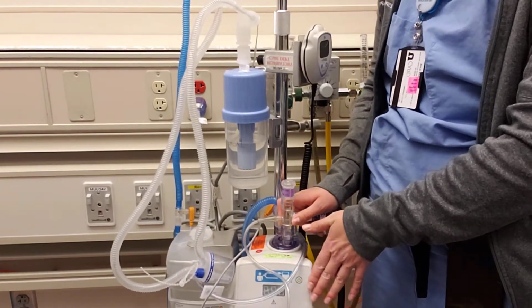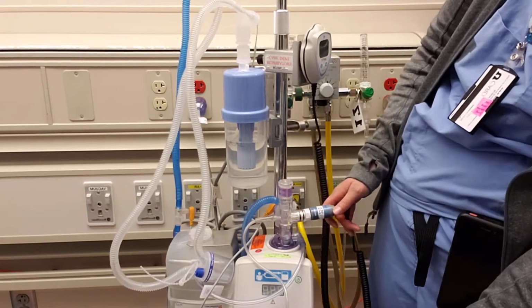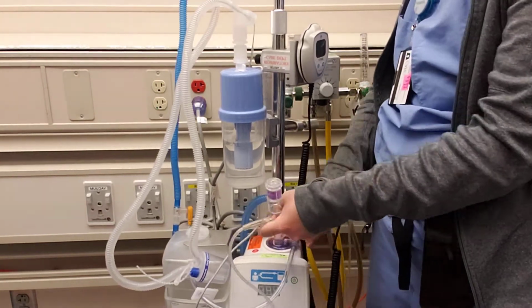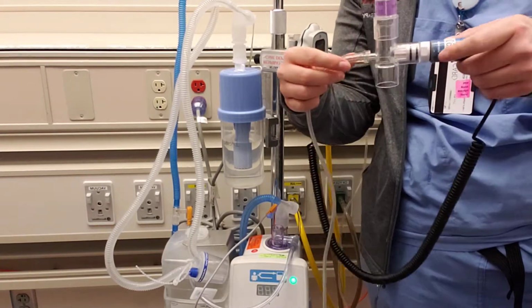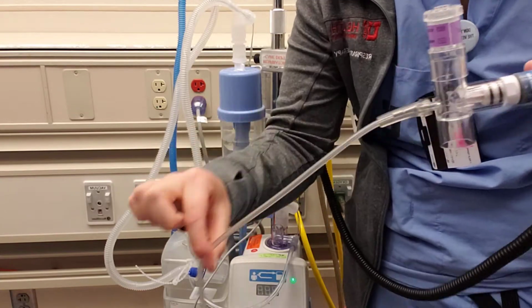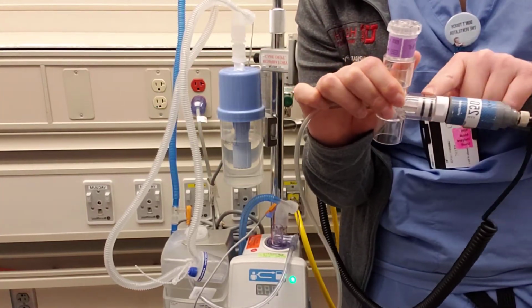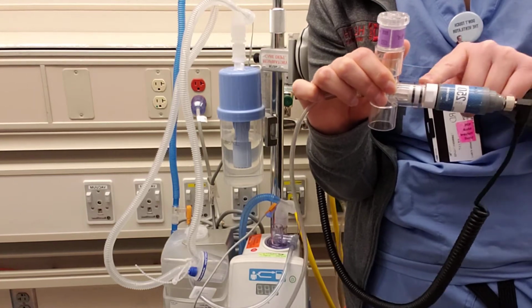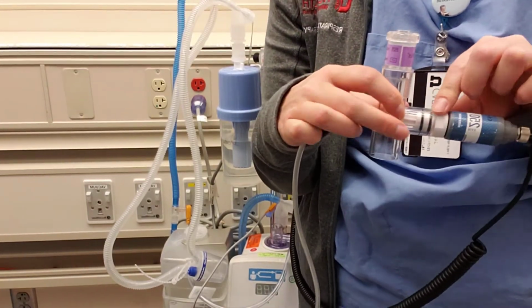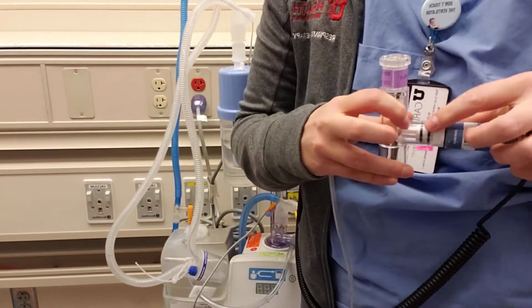This one specifically is, I think, a Hudson Concha heater. So we have a T-piece here, which connects to our flow, our 12 to 14 liters. We can put an oxygen analyzer on this side. One thing I found with practice is sometimes this will get a little bit loose and it'll kind of vibrate, so you can just twist it in and it will stay better.